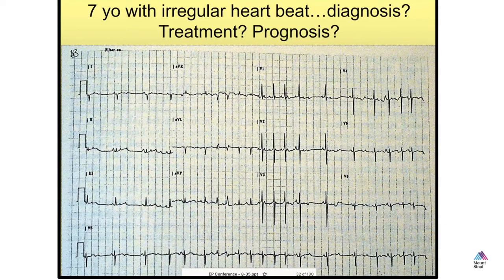So now if you didn't even have this tracing, and I just said to you, I have an EKG of someone who has a narrow QRS with an irregularly irregular rhythm, what would you think is the most likely diagnosis just based on that verbal description of the ECG? I don't know actually. So we would normally say that sounds like atrial fibrillation, right?